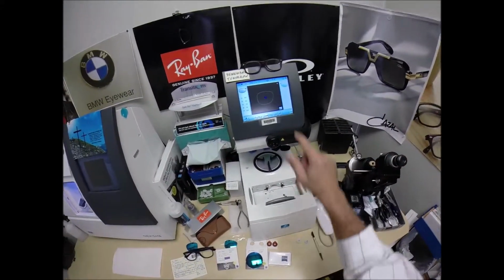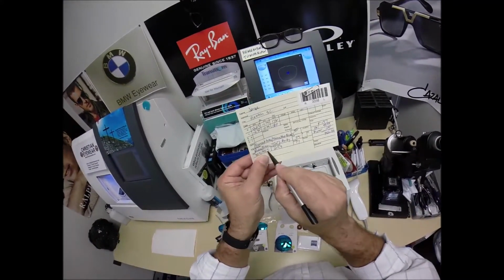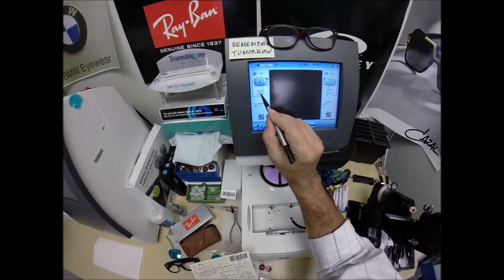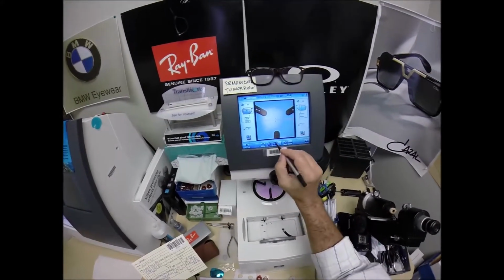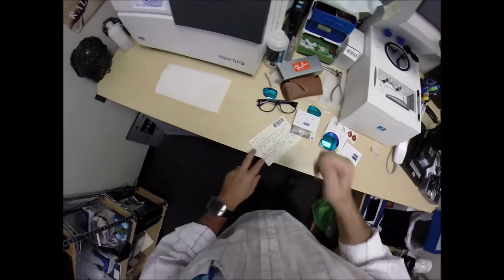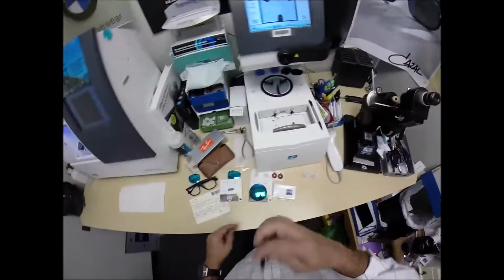So, that is the shape that I'll be cutting. I need to enter your pupillary distance, which is 32.5 for each eye. I'm going to move on to the next screen. The computer starts at 32.5, so I don't have to do anything except raise the optical center height to 24. I'm going to go two above the center and cut this at 24 millimeters high.